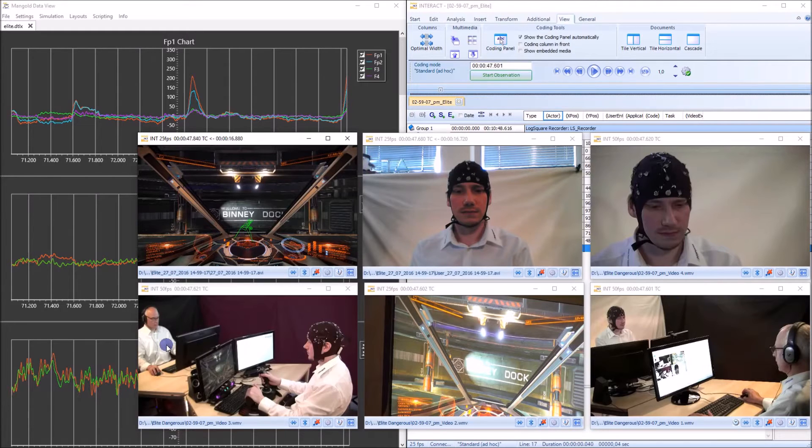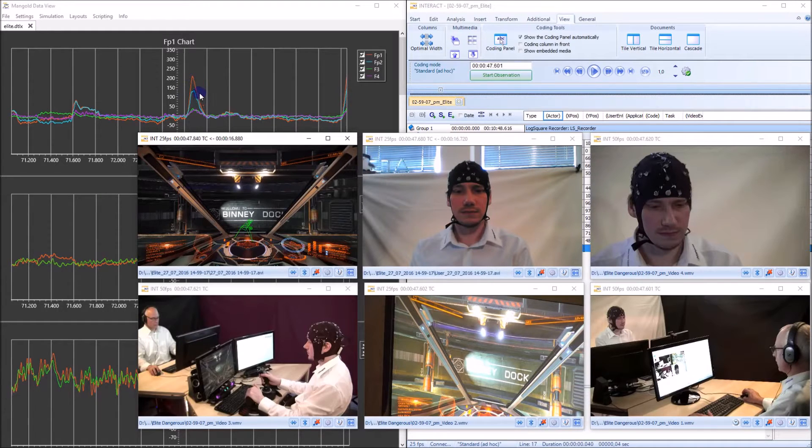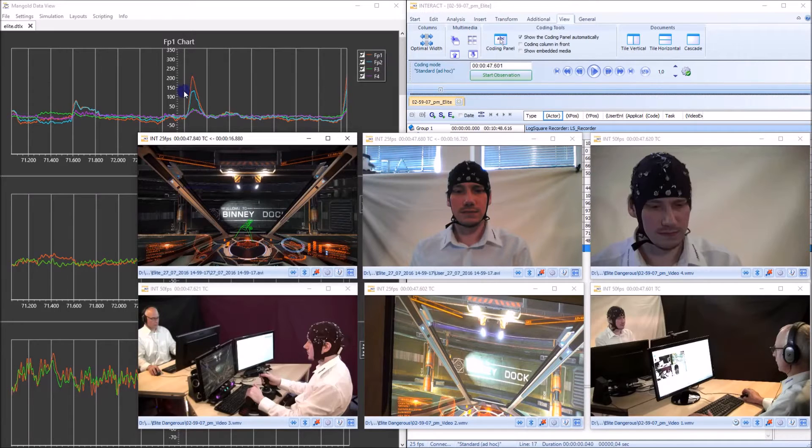Those four here, the other two were recorded through log square. But I'm interested in those peaks here of the FP1 and FP2 channel in our EEG data.